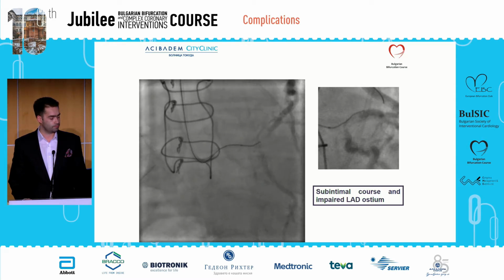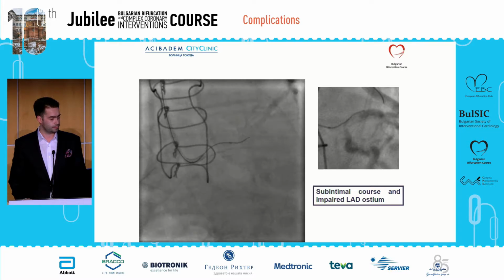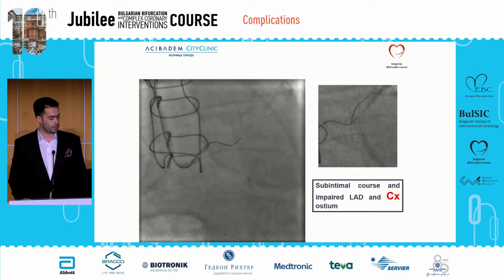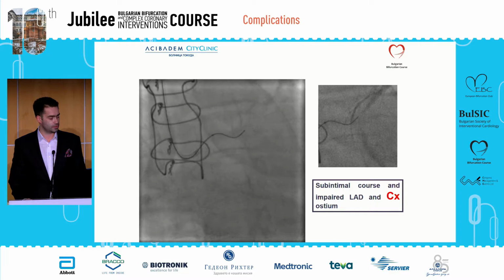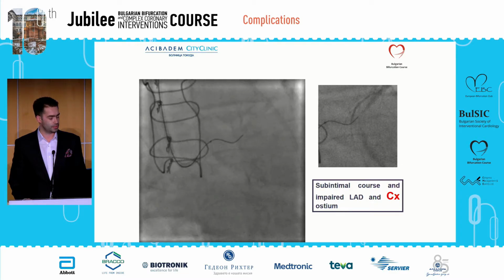We try to change that, to fix that. But we have compromise in the ostium of circumflex artery. You can appreciate it from here.